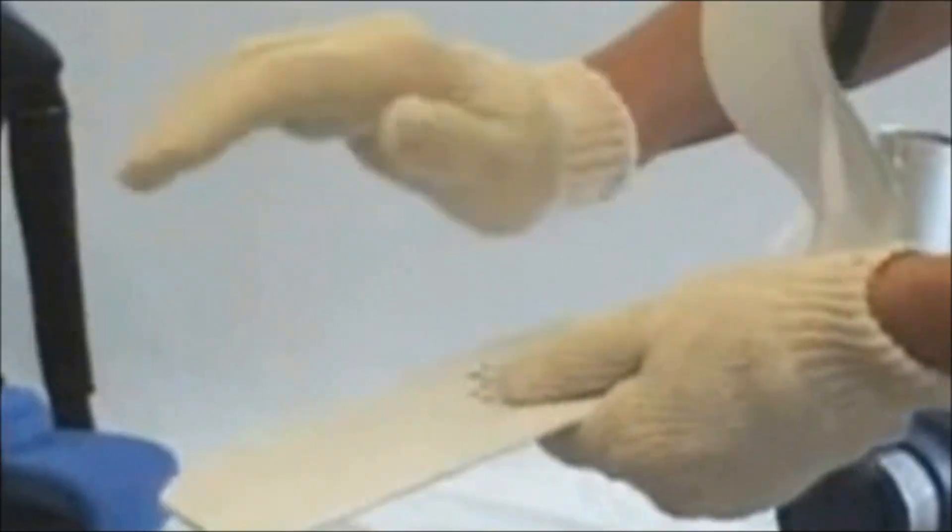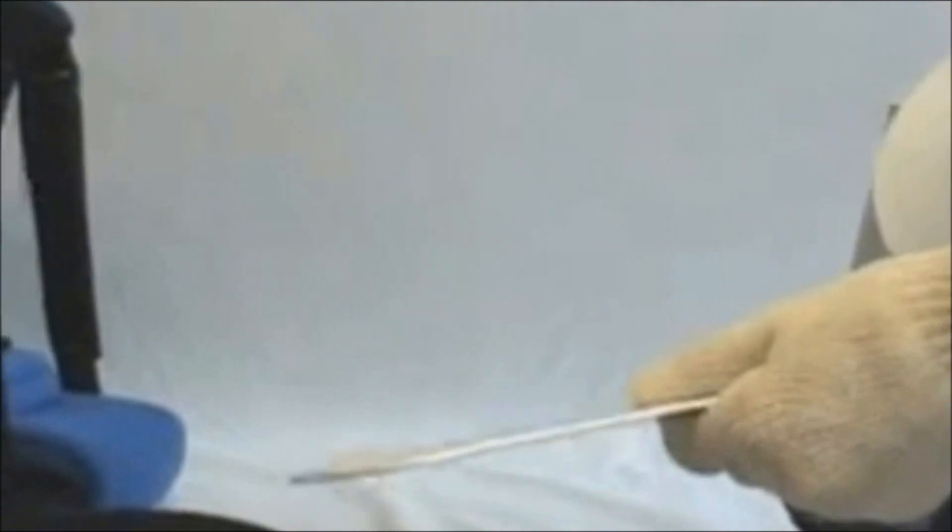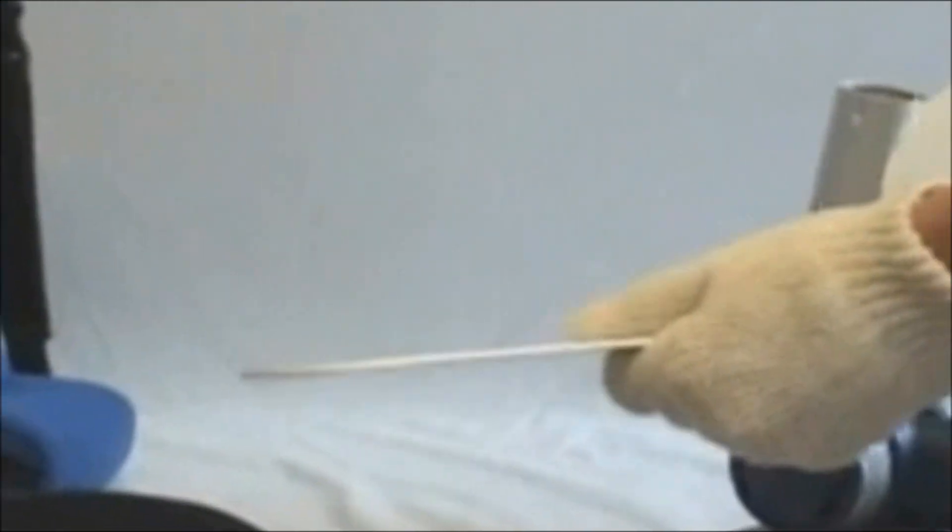Now if you have extensor tone, and the patient's foot is going down hard, the toes are firing down, then we want to protect those. It's much more effective and safer to mold the boot down to where the toes just have slight resistance.